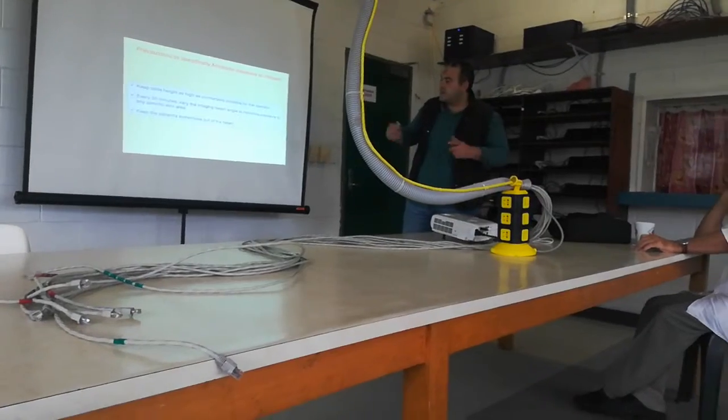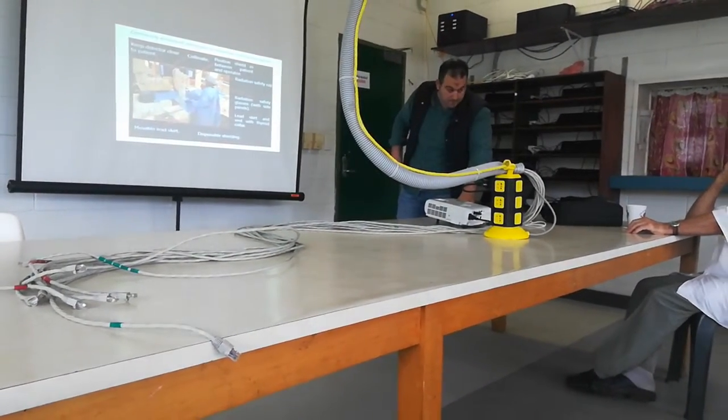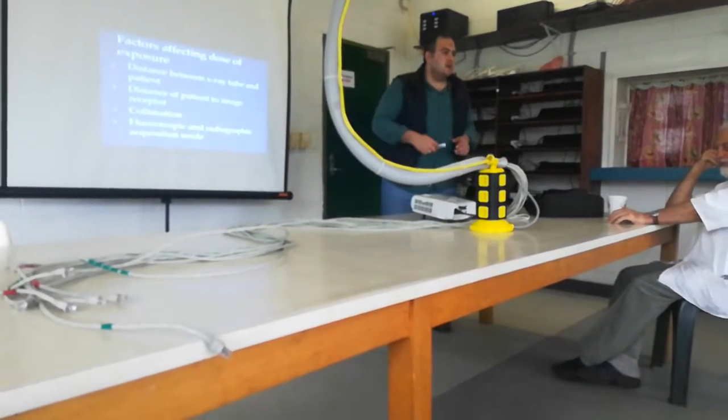Keep the patient extremities out of the beam, as well as the operator's extremities out from the beam.